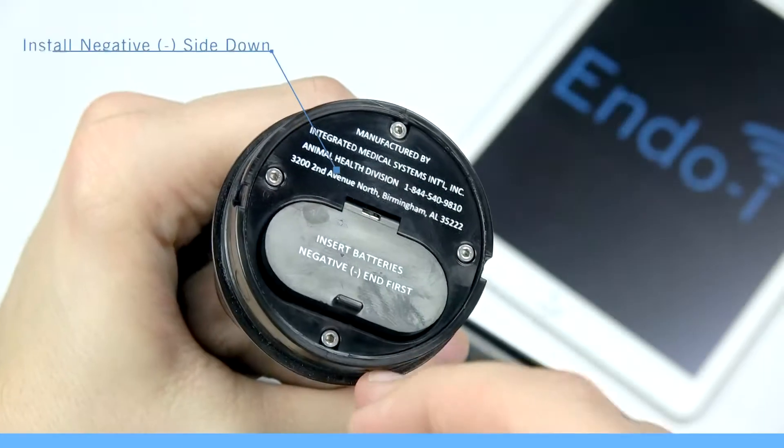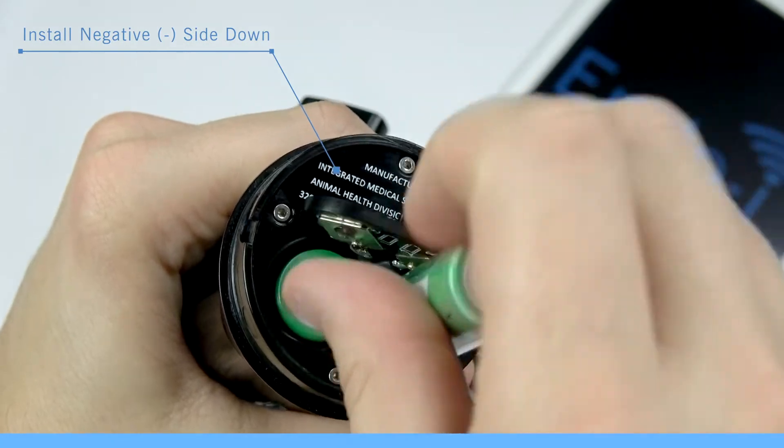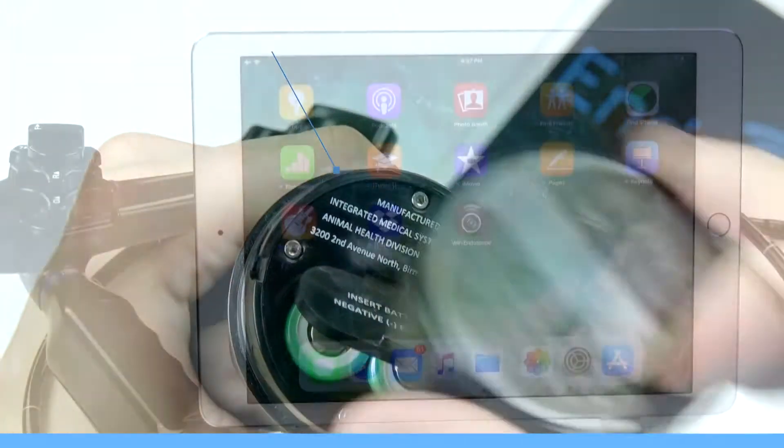First, make sure that you have fully charged and installed two of your EndoI lithium-ion batteries into your scope.